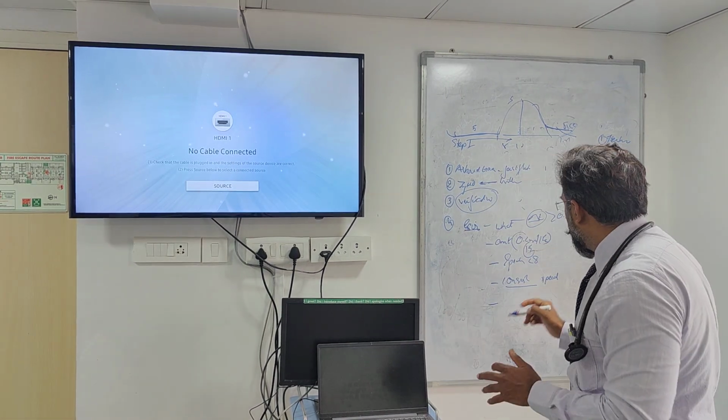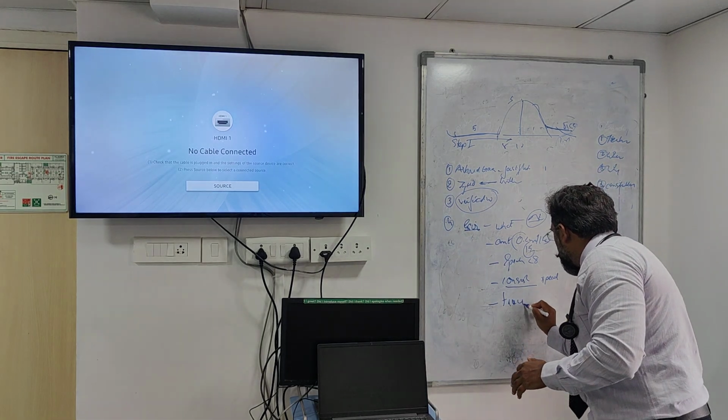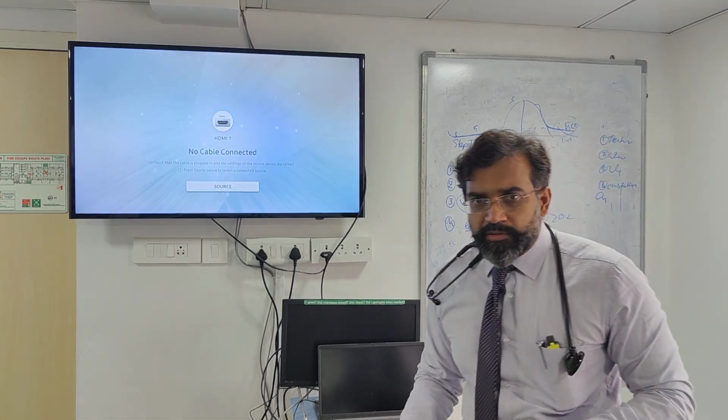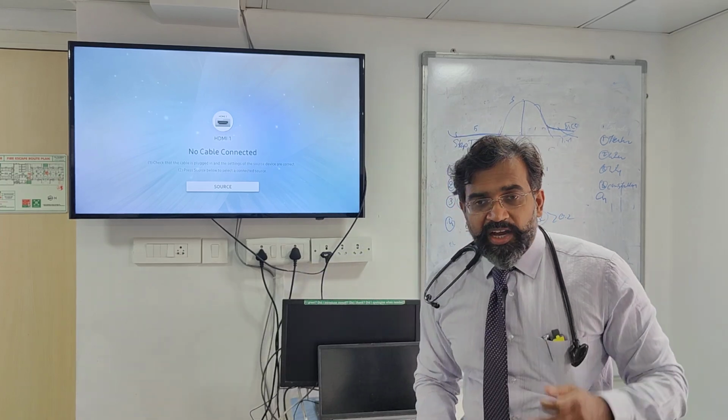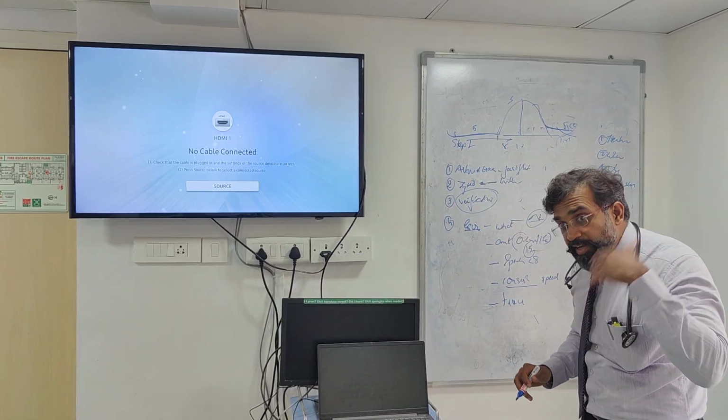So I'm going to look at my trace. My step is to look at my trace. Clear? After looking at my trace, I want to repeat the measurement 3 times.